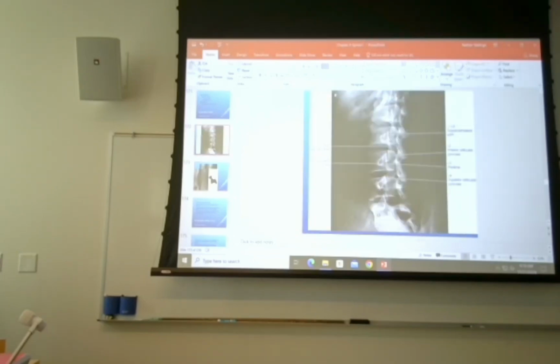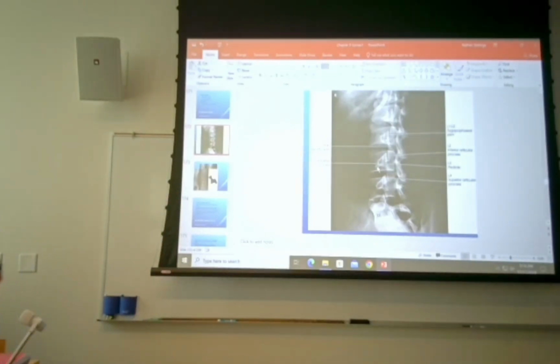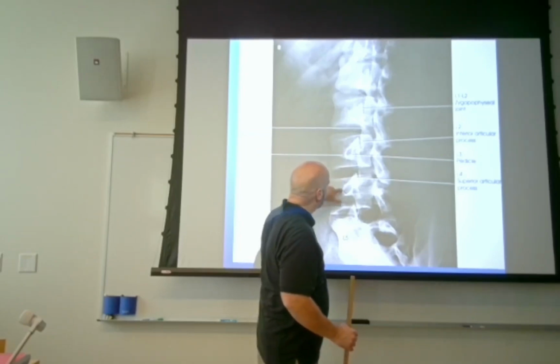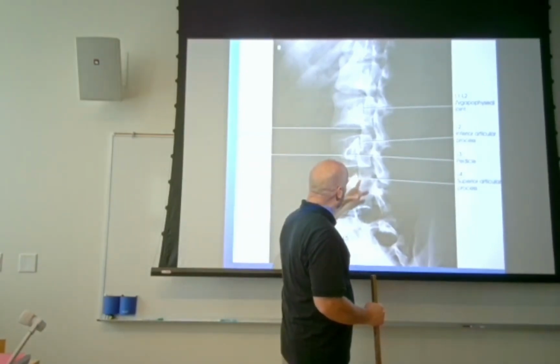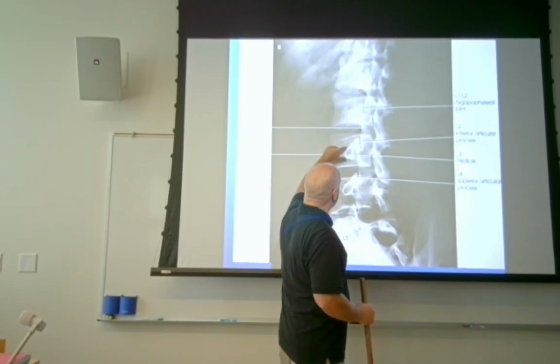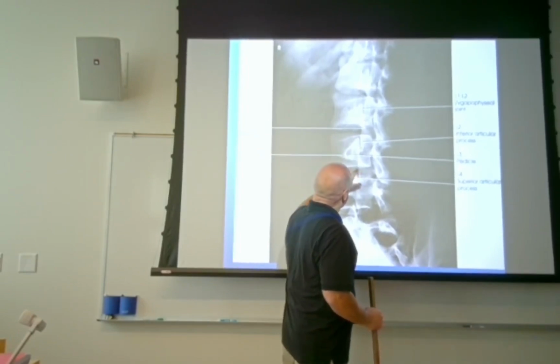So with a Scotty dog, what we see is the transverse process. That's that thing right there. All right. So transverse process, this thing is the nose. What we're looking at here is we're looking straight down onto the pedicle. Our zygapophyseal joint is this thing right here. So this is an ear. It's a nose. This nose is kind of going up in the air a little bit more, so we're going to go with this one. Nose, eye, ear. Then on this vertebra down here, we've got the leg.